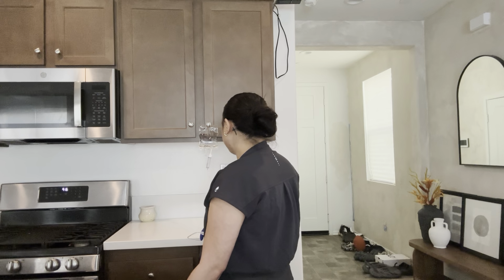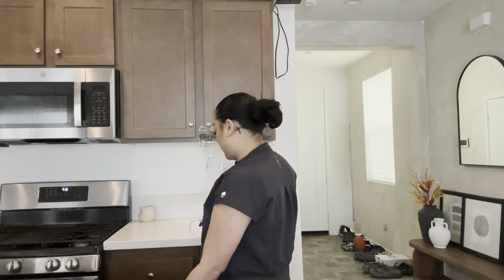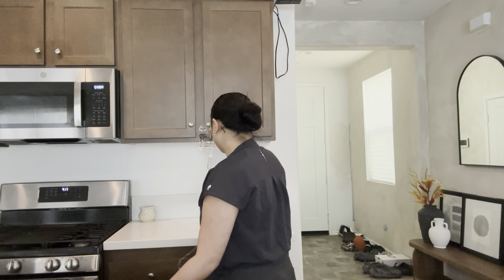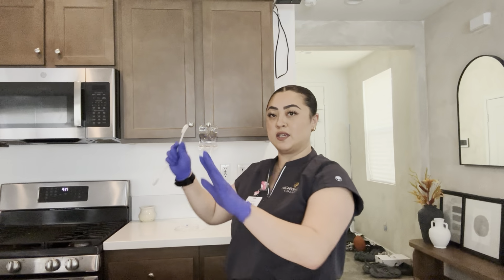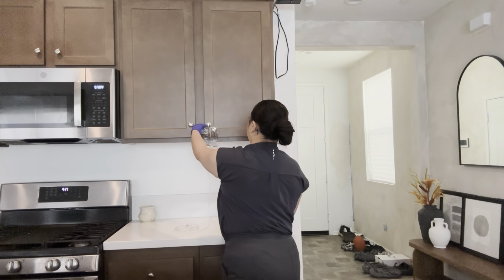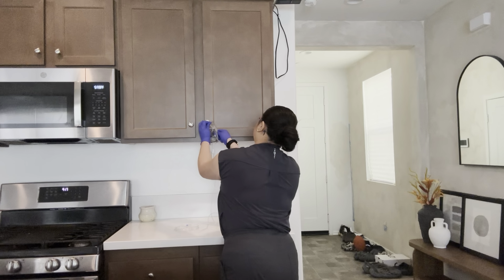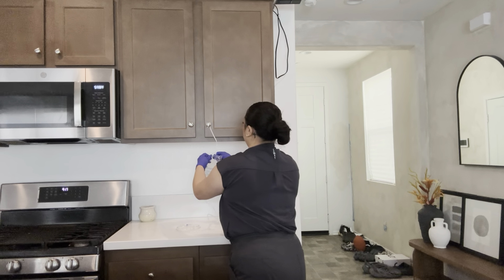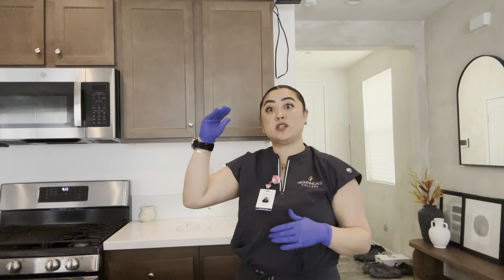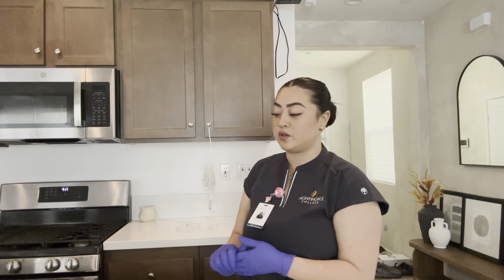Okay, so at a minute, I do have it at the 38 drops. So now I'm gonna move on to the second portion. And I'm just gonna prep this really quick, like I said, because I don't have the IV pole here. So I'm just gonna stick this on here. And this is how I'm gonna be able to ensure that the medication bag is above my primary one, which is very important because we want to make sure that the medication goes through first.